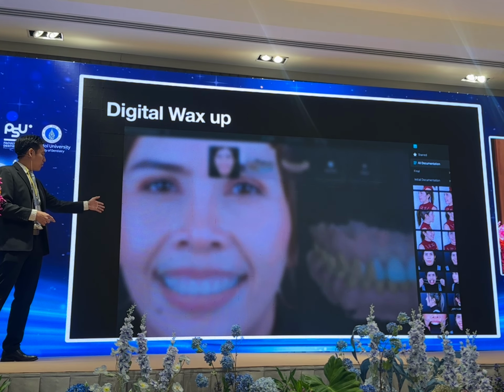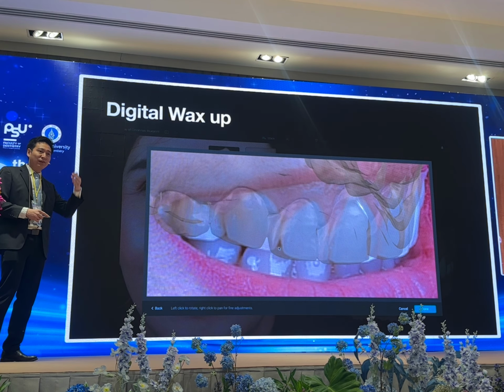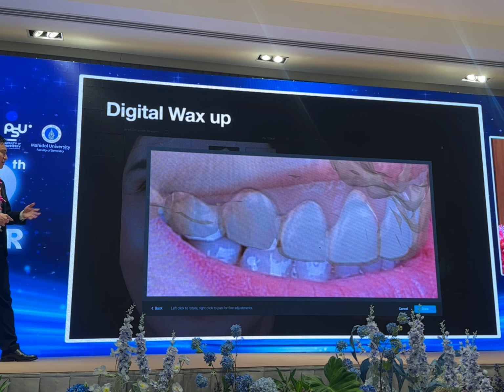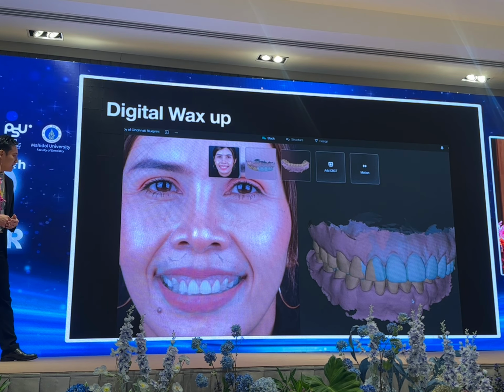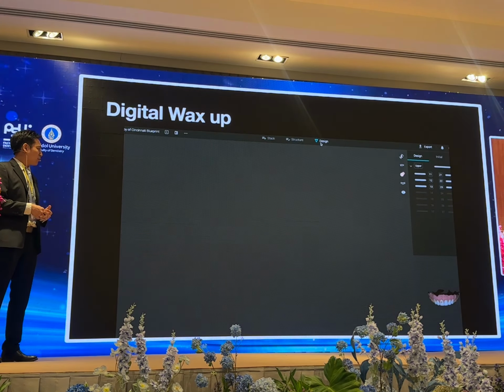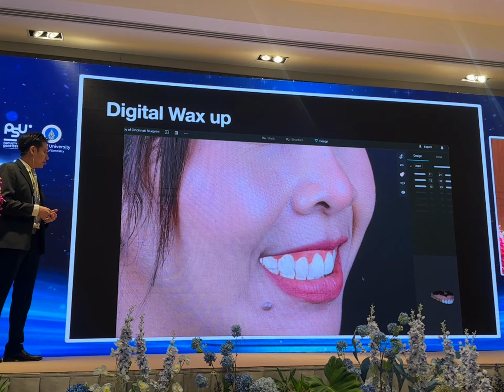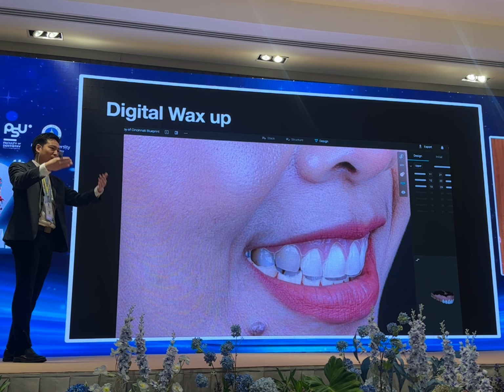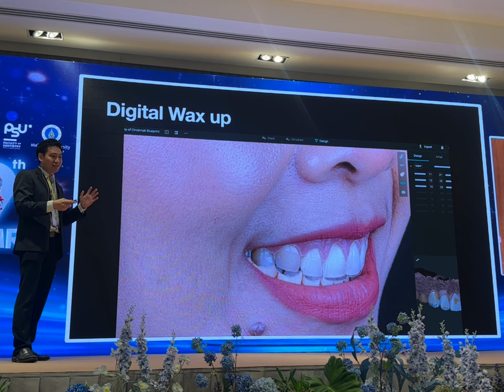If you think that only the frontal view is not enough, with the software right now, you can see the side of the patient. The software can merge what we just decided to the lateral side of the patient, and after matching together, it can generate the final outcome for your patient. With this you will notice immediately if the teeth are a little bit too inward or too outward, or about right at the lower lip. Because this is a 3D dimension, we can see in every direction.